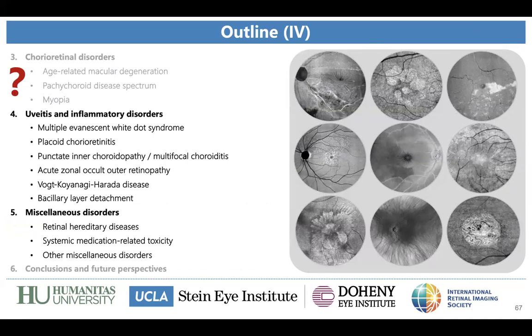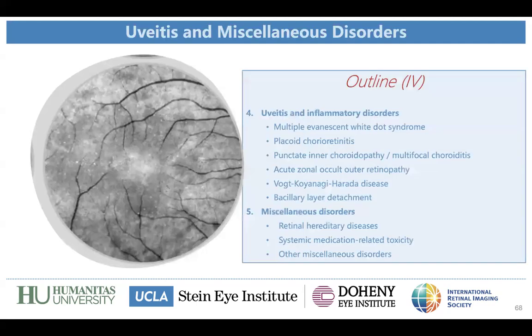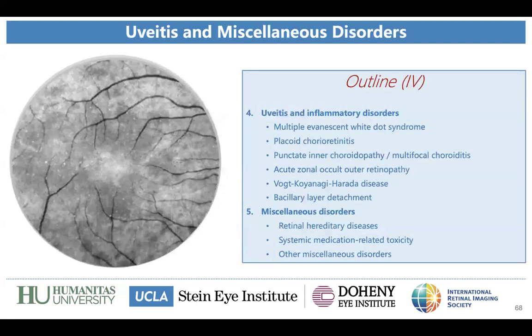Okay, sure. So let's move now to the fourth and final part of the presentation. I know it's a lot of information. I just try to give you an overview of all these conditions. So moving to uveitis and inflammatory disorders.